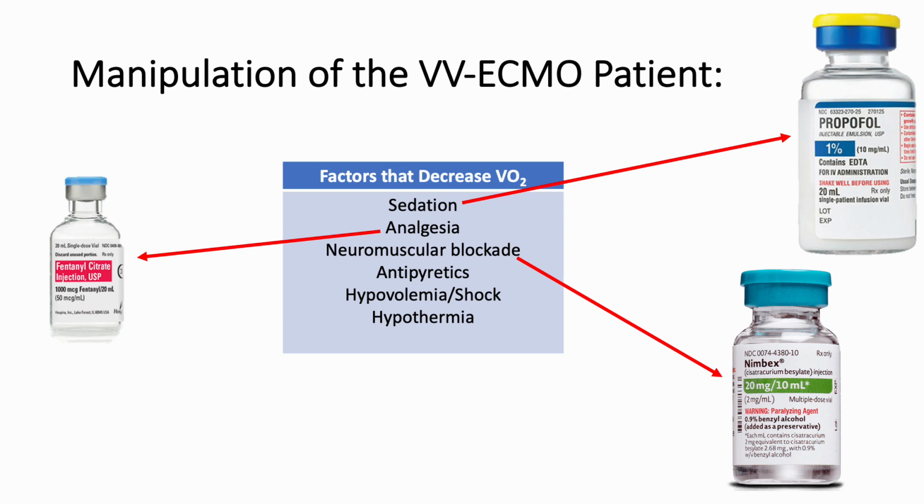In addition to protecting the patient from accidental decannulation, that is, literally the cannula accidentally falling out of the patient, sedation and paralytics are beneficial for reducing patient oxygen consumption, VO2, as mentioned previously, and for reducing changes in intrathoracic and intra-abdominal pressures as a consequence of muscular contraction that can lead to chatter or even suck down events through physical external compression of the IVC.